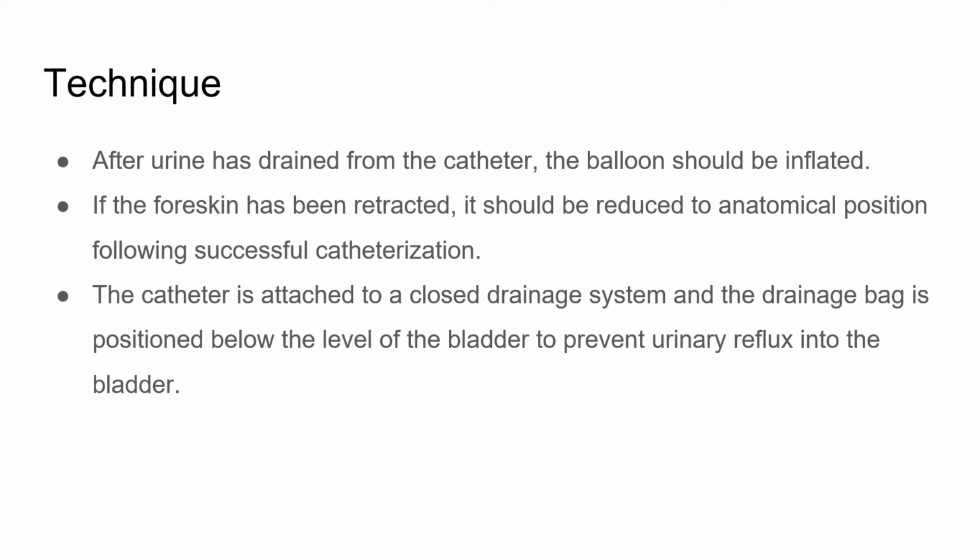The catheter is attached to the closed drainage system and drainage bag. So this should not be kept open; rather, it should be put into a closed drainage system, and the drainage bag positioned below the level of the bladder. So it should not be done that the uro bag is kept above the level of the bladder. It is gravity dependent, so it has to be kept below the level of the bladder to prevent urinary reflux into the bladder.